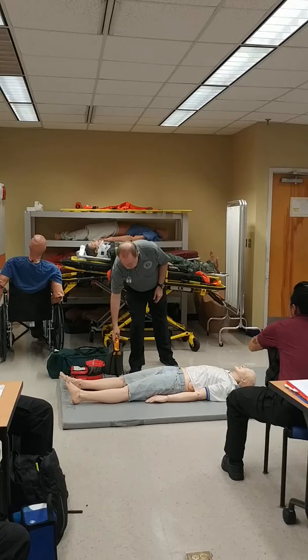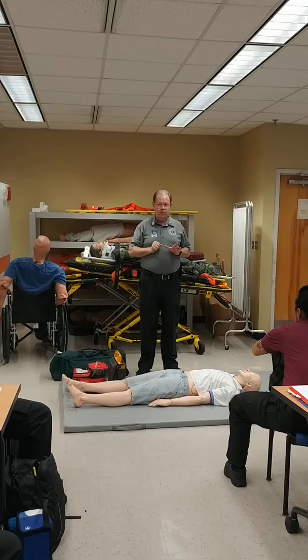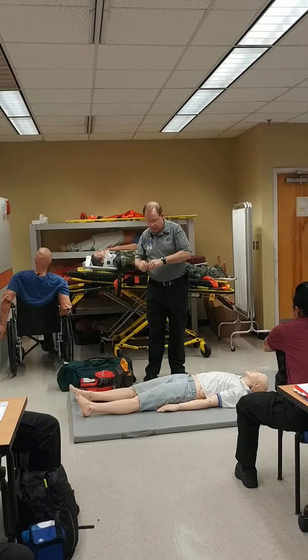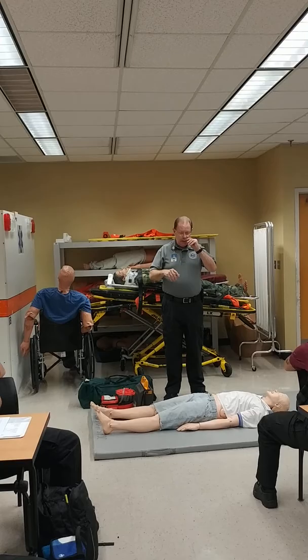Once it starts, remember the person that's bagging — where should the bag be? Right next to us, at the head. I'm doing CPR, so that means I've got 30 compressions between squeezes. Squeeze, squeeze. One-one-thousand, two-one-thousand, three-one-thousand. We're going to be doing about 110 to 120 compressions.